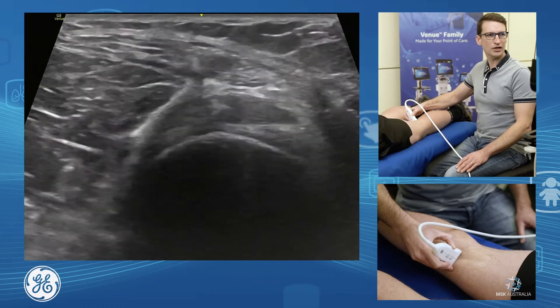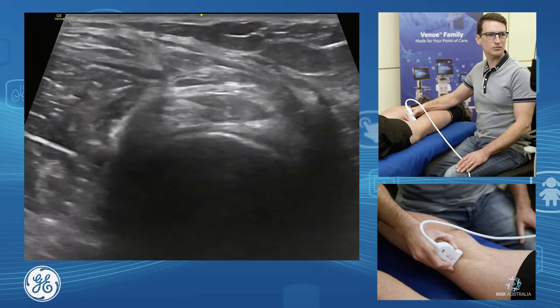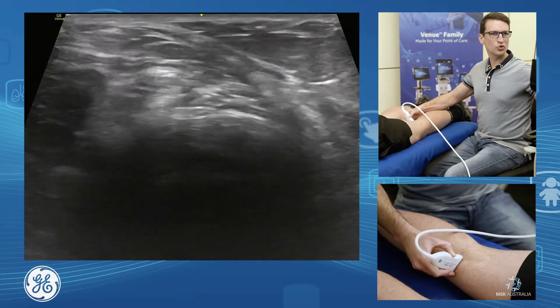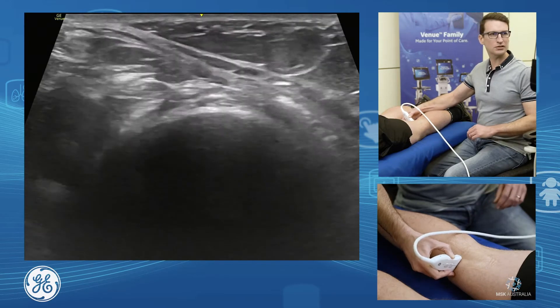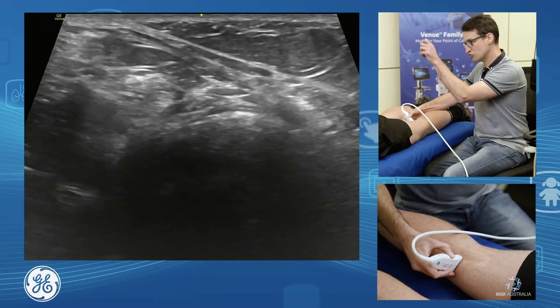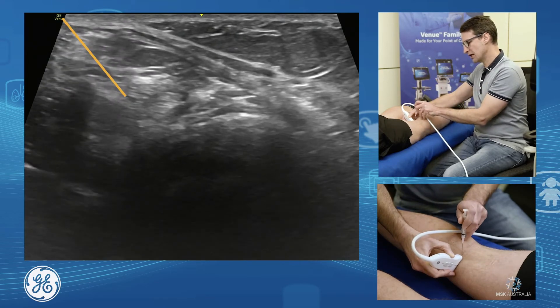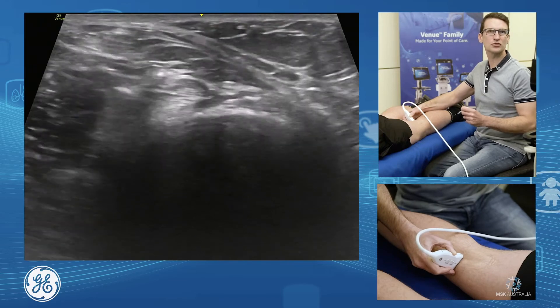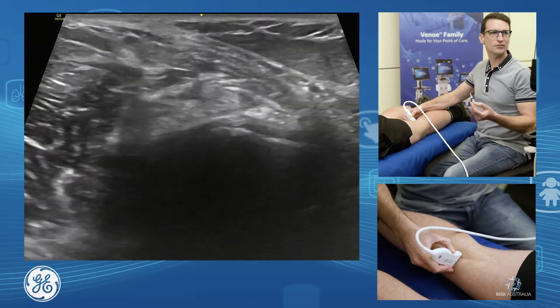We might need to aspirate our Baker's cyst, so what we do is we'll find the cyst, move our probe around medially to give ourselves a little space, and then it's just a simple drop almost vertically down into the Baker's cyst, away from any arteries and nerves. And that's our posterior knee.